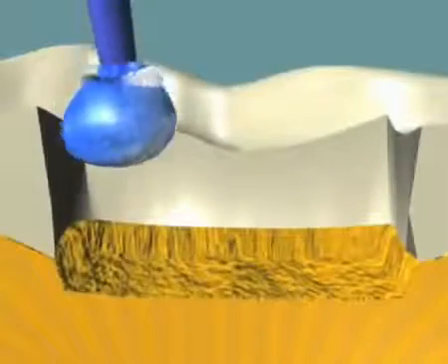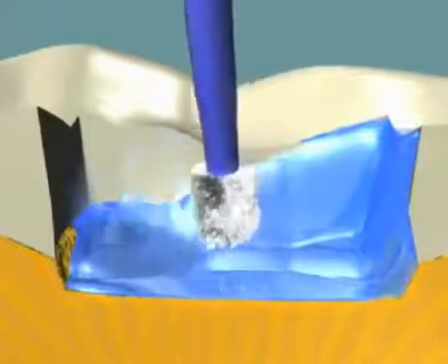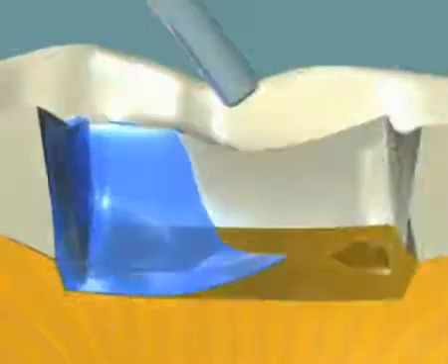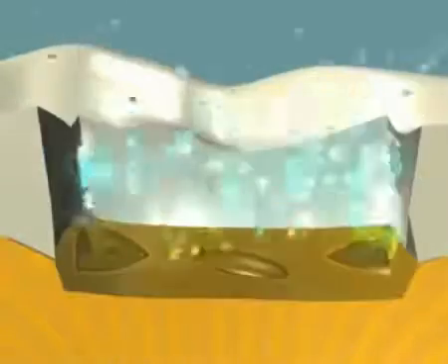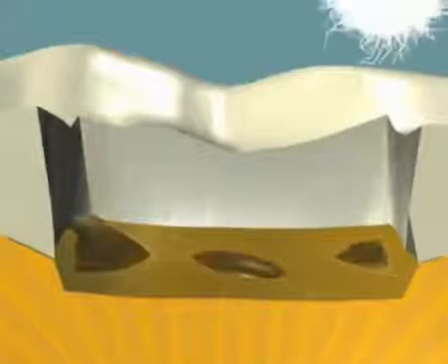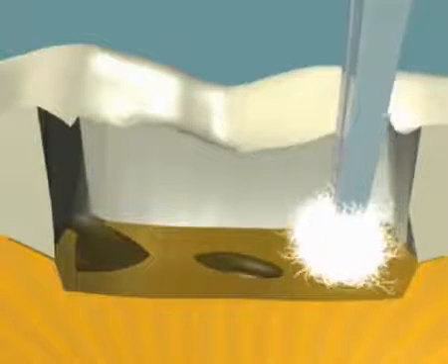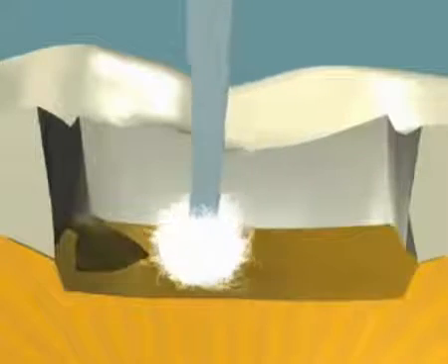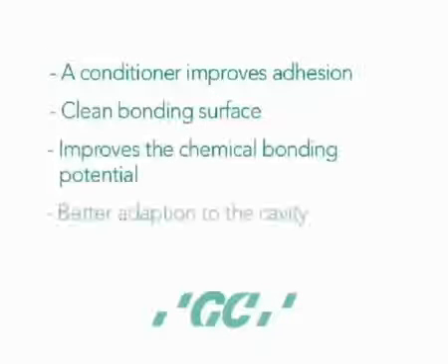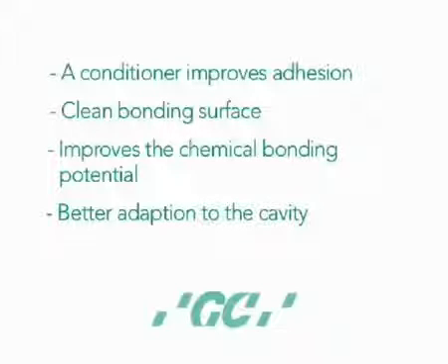Prior to placement of the glass ionomer, it is helpful to prepare the cavity surface by applying a polyacrylic acid conditioner. After 10 seconds, the conditioner is washed off, removing the smear layer and surface debris. Excess water is then removed without over-drying the surface. Using a conditioner improves adhesion in three ways: it creates a clean bonding surface, it improves the chemical bonding potential of the glass ionomer cement, and it alters the surface energy of the tooth so that the cement can wet and adapt the cavity more effectively.